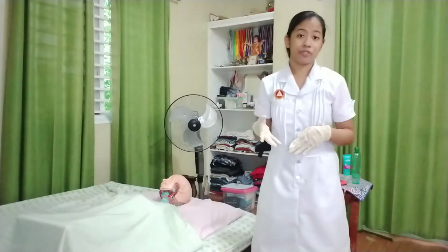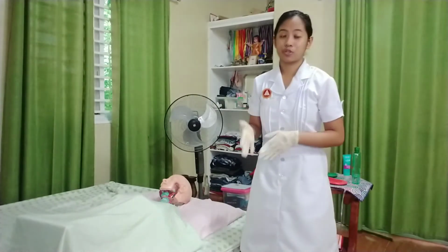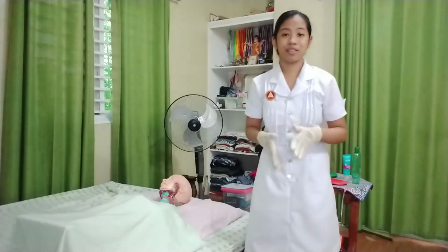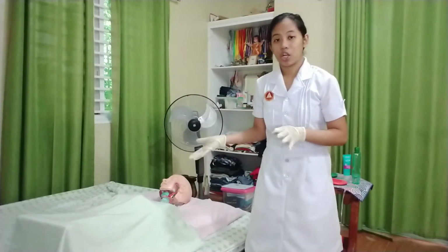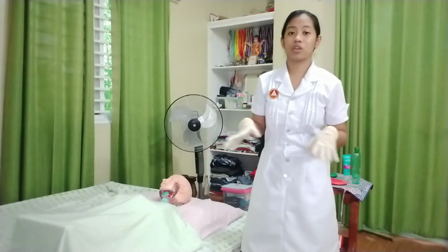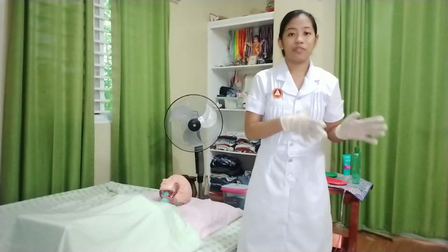Now, for return flow enemas, we are using a 100 to 200 ml solution, and we will instill it through the rectum and the sigmoid colon, and then we will lower the container so that the fluid will flow back through the rectal tubing to the container, and so on and so forth, pulling the flatus with it.